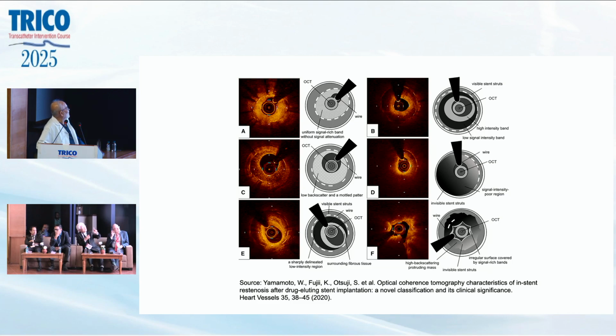But generally speaking, type A, DCB is very useful, and type F might be what we need. This A is type 1. This is 2, 3, 4, 5, 6. That is what they have described. Yeah, there is no significant difference between DCB and normal balloon, right?